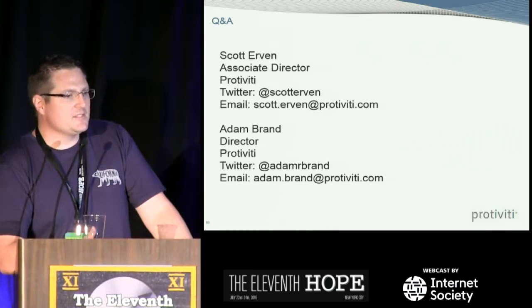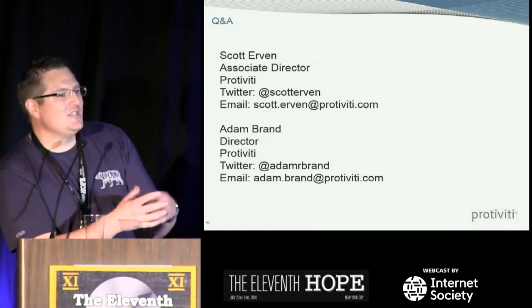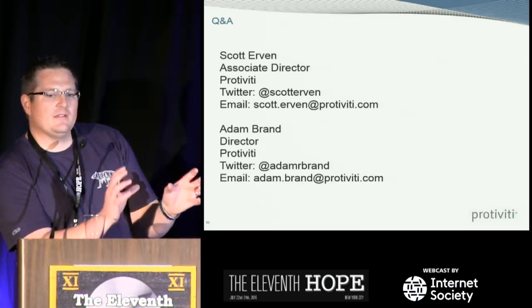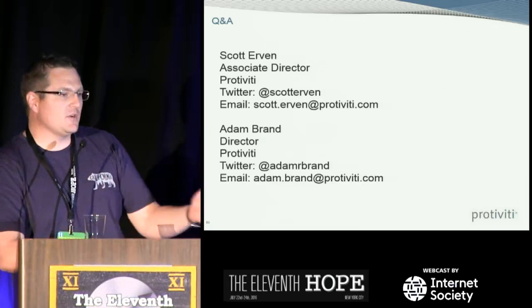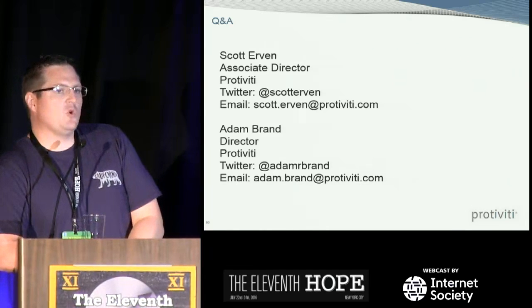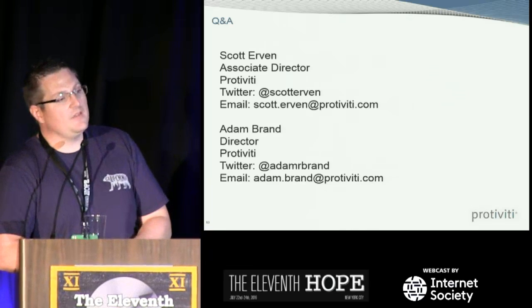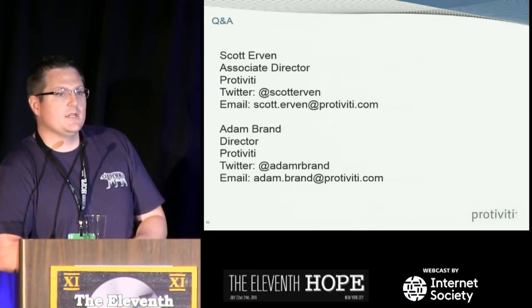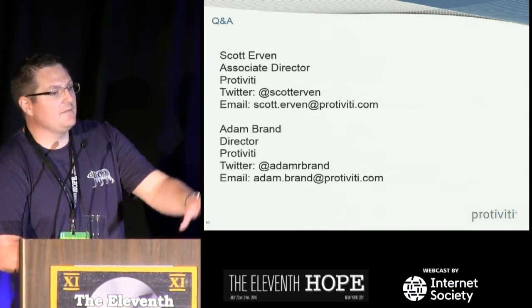And some of the similarities with the ICS infrastructure were close enough to where some of these manufacturers, so the GE or the Philips or the Siemens, they have ICS type equipment, and so they had a contact with them, and so they kind of started that route, and then now it does get shared through. I would say more so than HHS so far taking a stance has been the FDA involvement. It still has not been completely sorted out from an OCR or a HIPAA patient privacy perspective.